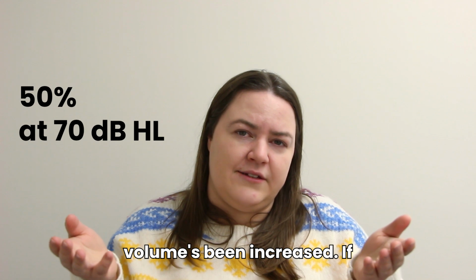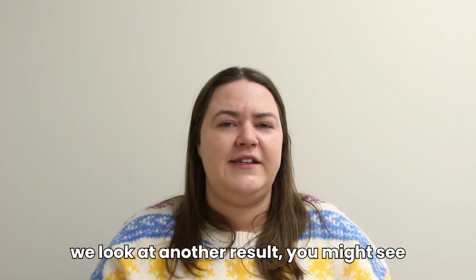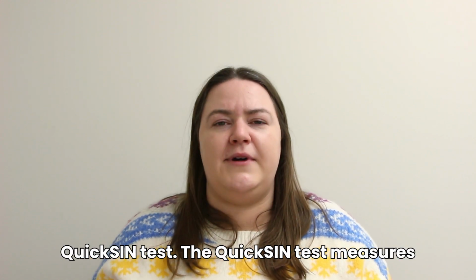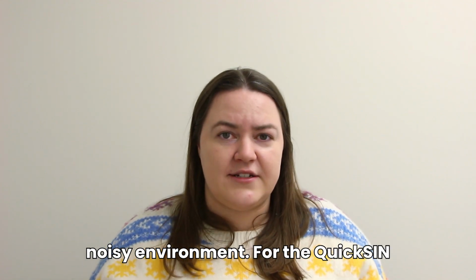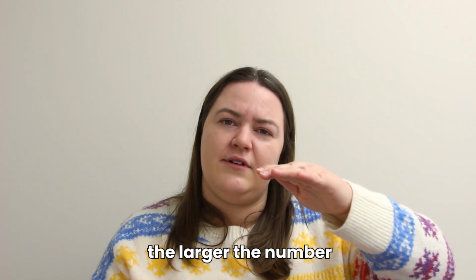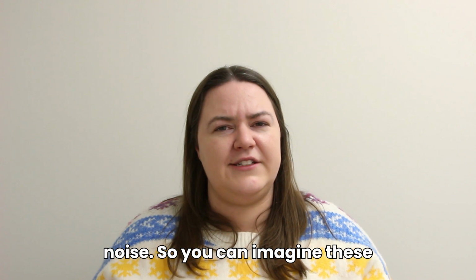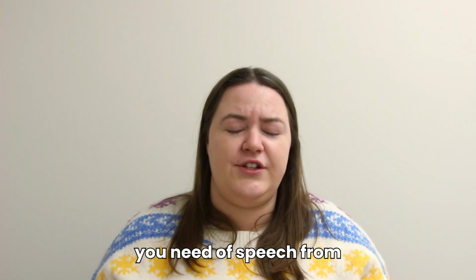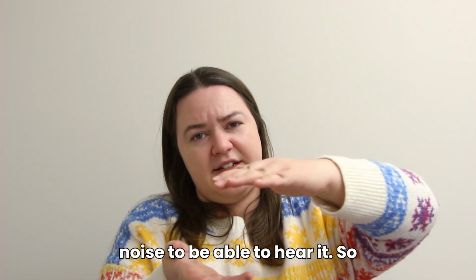If we look at another result, you might see the results of what's called the QuickSIN test. The QuickSIN measures how well you can understand speech in a noisy environment. For the QuickSIN, the larger the number means the more trouble you're having in noise. So you can imagine these results as showing how much separation you need of speech from noise to be able to hear it.